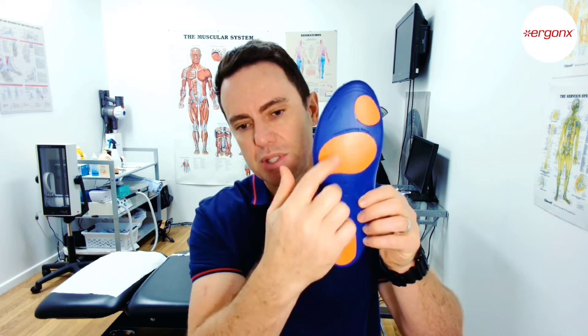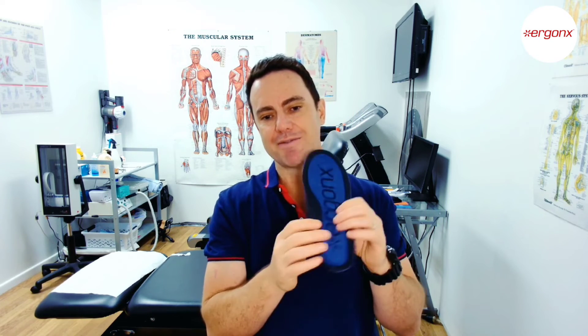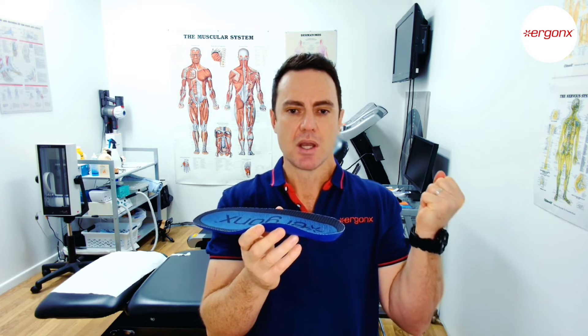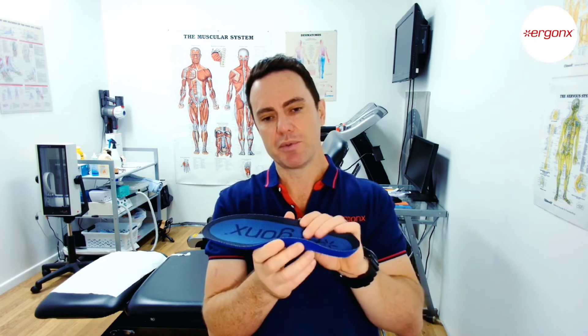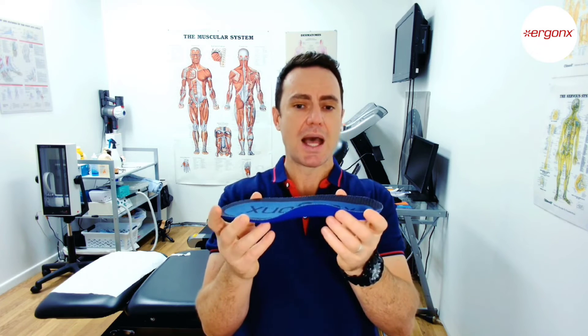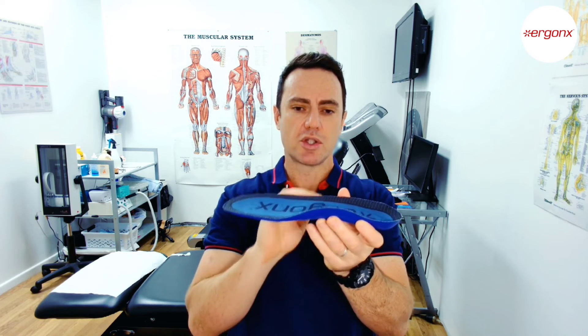It also has cushioning which helps to pad the foot and makes it a lot more comfortable across the work day, because a lot of work boots are very hard and very rigid — they're made to protect the feet, but not a lot of thought has been put into making them more comfortable. So by adding a soft, supportive orthotic inner sole to the work boot, we help make the boot a lot more comfortable across the work day.